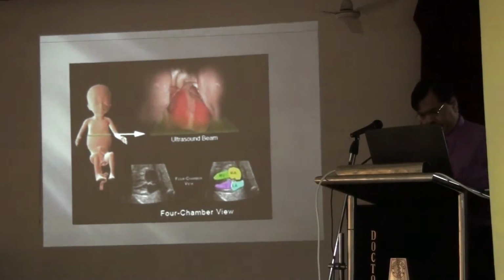So these are, in a nutshell, the common outcomes. So sir, basically echocardiography is a diagnostic, aiding tool. From big machines to handheld laptop-like machines already exist.